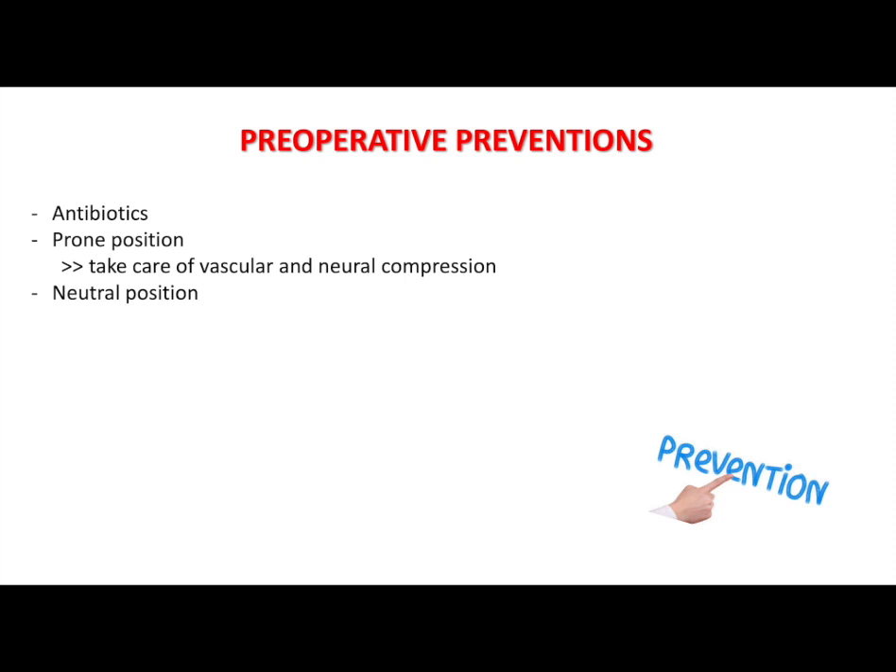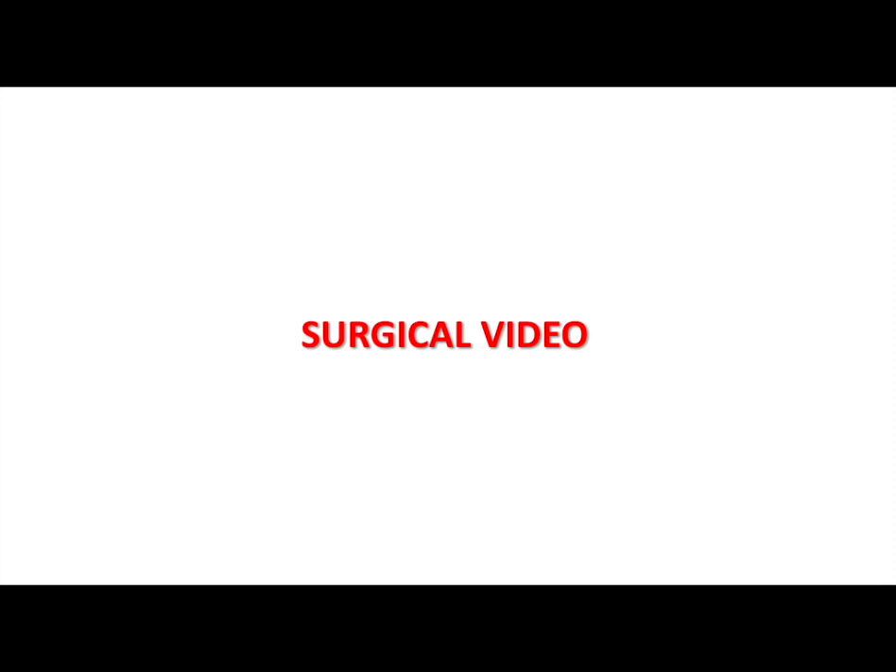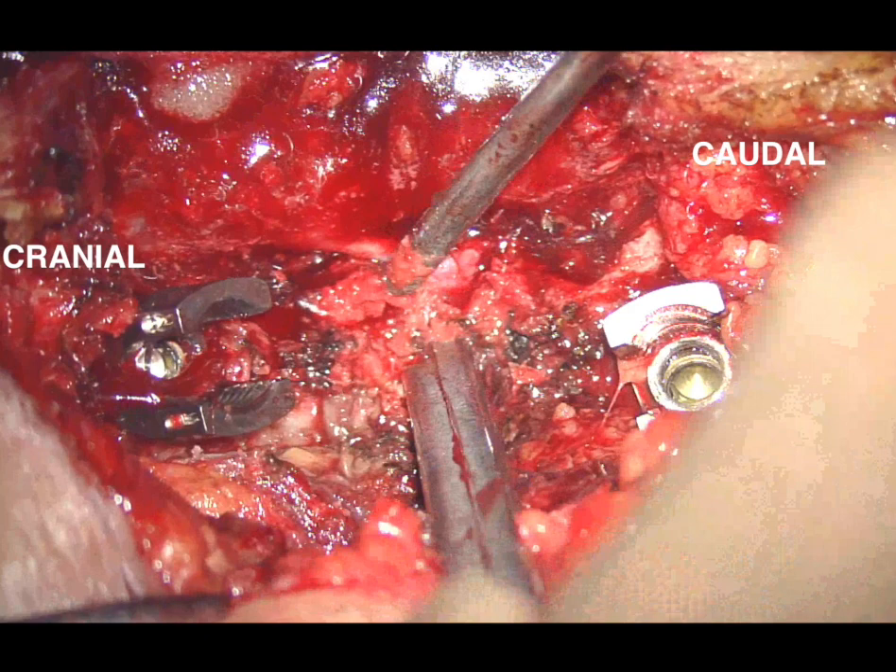Neuromonitoring probes were placed. The surgical field was cleaned and draped sterile. After correct orientation under fluoroscopy, an L2 to S1 median skin incision was performed. With blunt dissection and monopolar cautery the subcutaneous tissues and muscles are dissected.